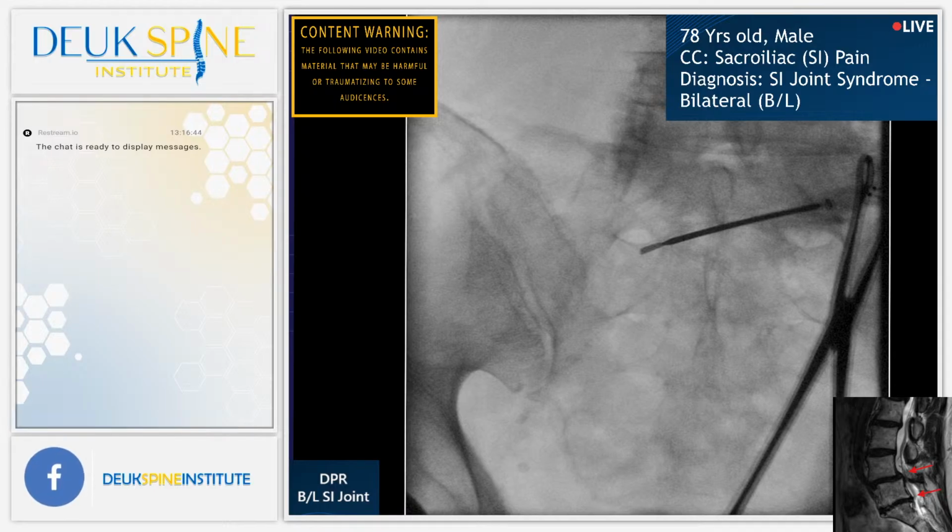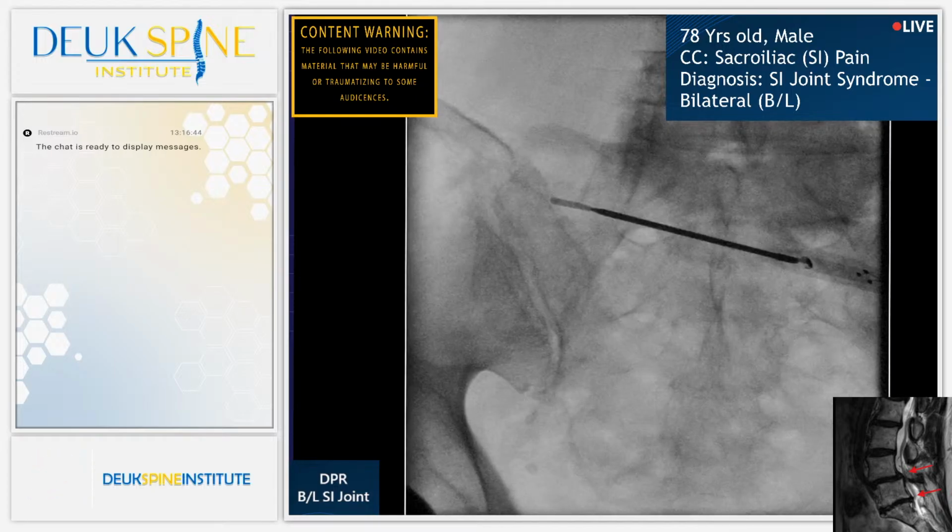Shot. Oh yeah, that's nice. I think that's as much as I can do.